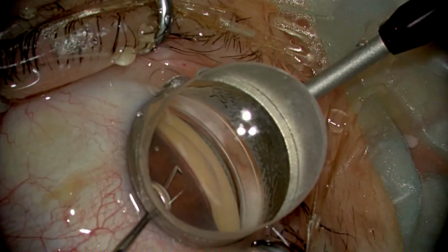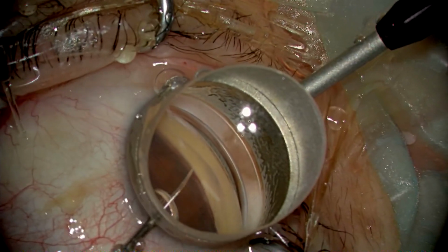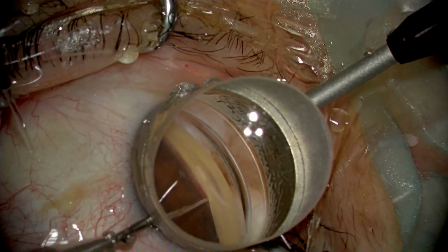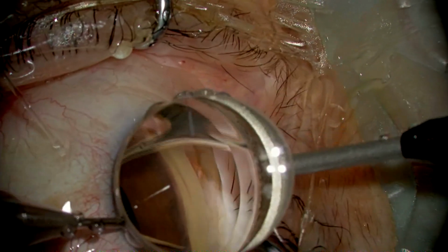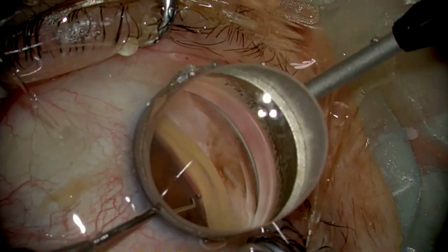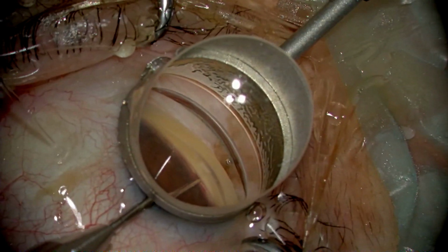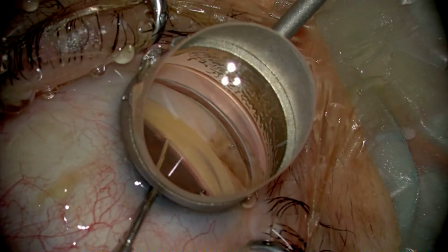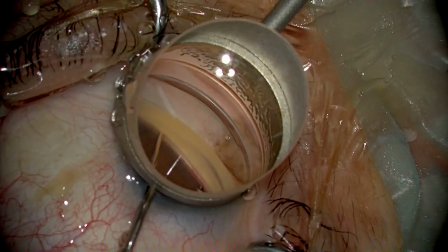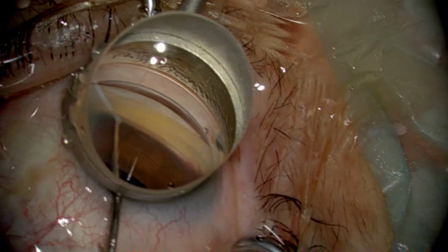Here are the tips for the TMH. When inserting the tip of the hook into the Schlemm's canal, in order to minimize damage to the outer wall of the Schlemm's canal, it is recommended that the meshwork be perforated by gently sliding rather than stabbing. To avoid unintended tissue damage around the trabecular meshwork, the correct insertion, direction, and depth of the tip of the hook should be monitored carefully during the procedure.